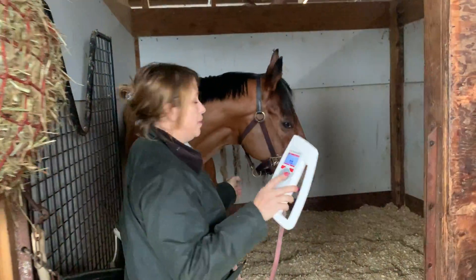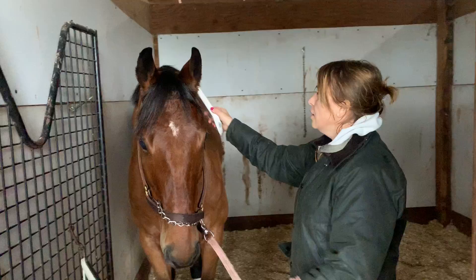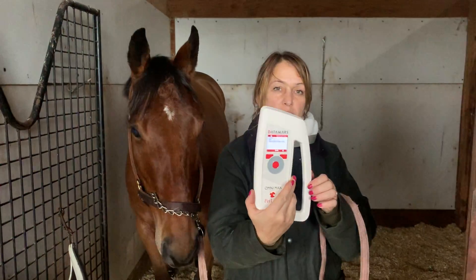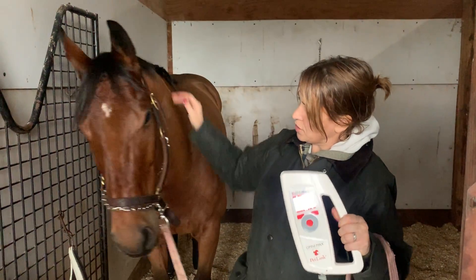And if we check him, he'll come up with the number which will be associated with his name for the rest of his life to protect him.